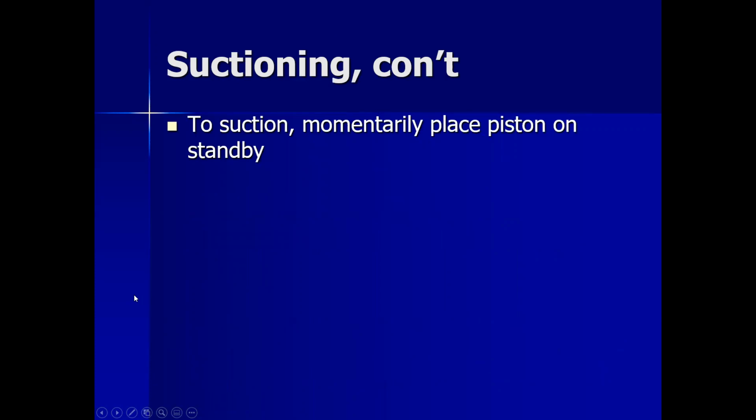So you have to stop the piston when you're suctioning. That's something else that's crazy, right? Stop the piston. And it's okay because you'll still have all of that extra flow from the mean airway pressure. So the patient, if they're not heavily sedated or paralyzed with a muscle paralytic, can breathe with the piston stopped. They just get all that flow that's going through the circuit.